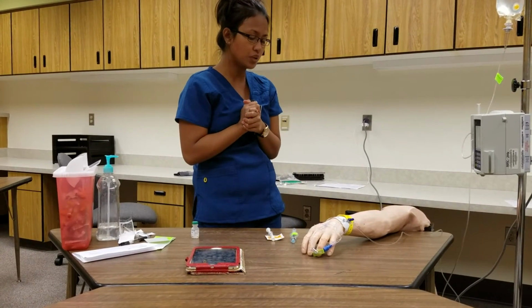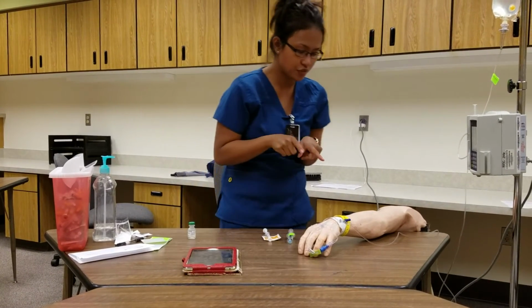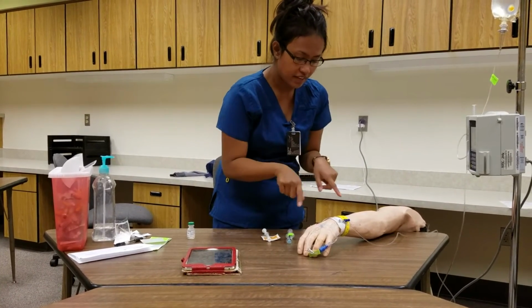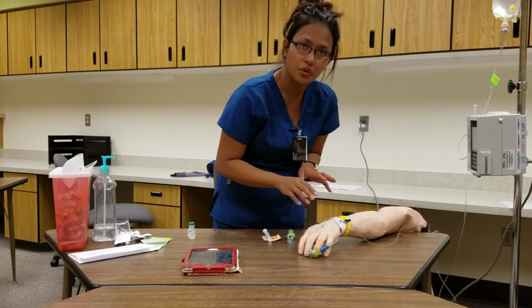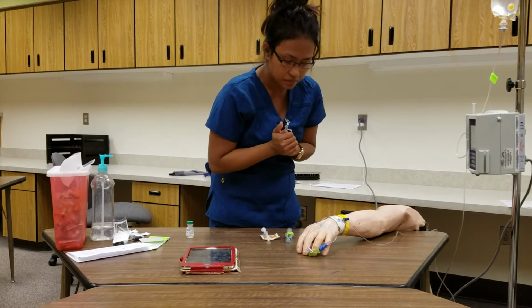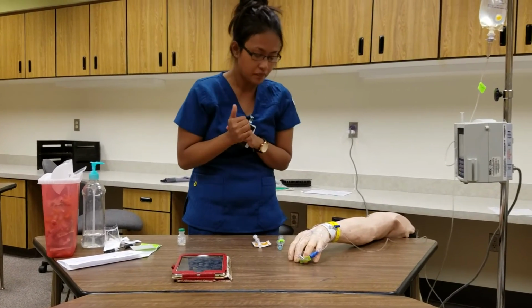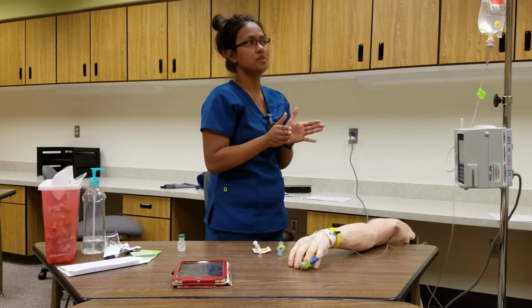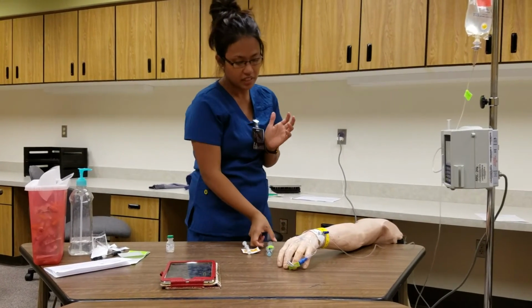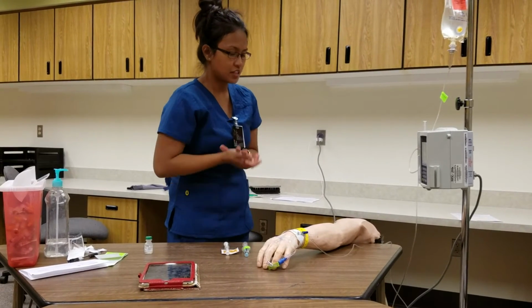What I want to do is assess first. I want to wash my hands. I want to assess Miss Sandra Jones' IV site for any infiltration or any signs of phlebitis. So I'm checking. It looks good. There's no signs of infection. Anything looks normal to me. I will be explaining to Miss Jones the medication that she'll be getting, that she'll be getting some morphine, and it's for pain.